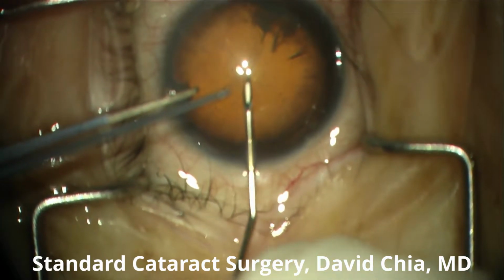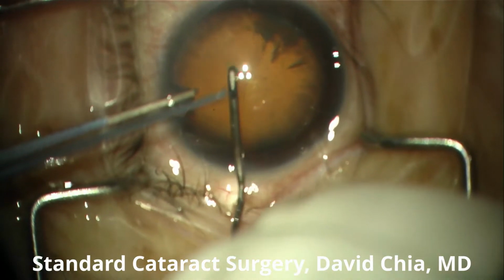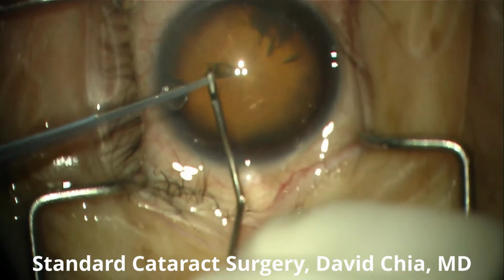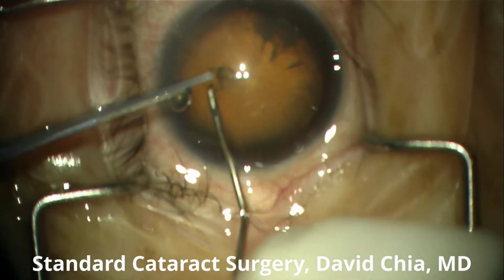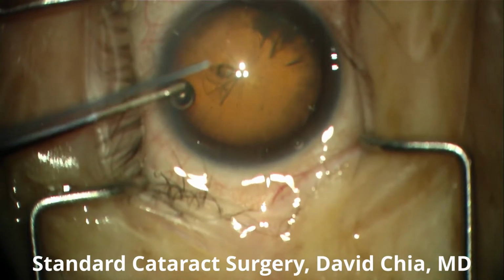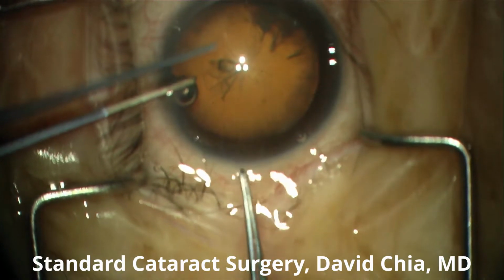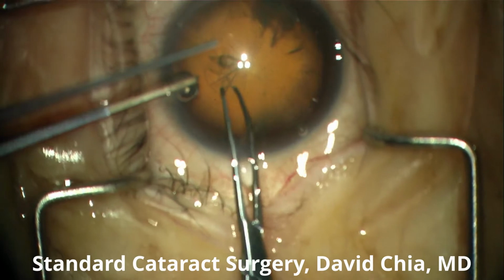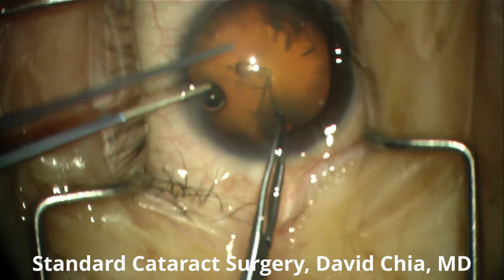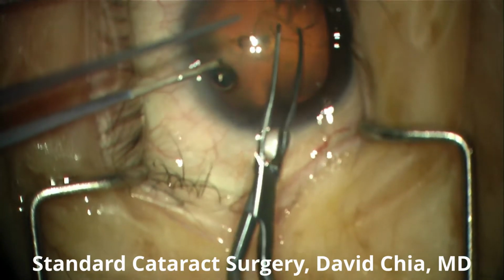Here we've inserted a bent needle cystotome and we're making an incision in the anterior capsule. And here we're creating a continuous curvilinear capsulorhexis, in other words, a circular opening in which to access the cataract and remove its contents and place the future intraocular lens. It is very important that the capsulorhexis is sized appropriately and generally is between 5 to 6 millimeters in diameter.